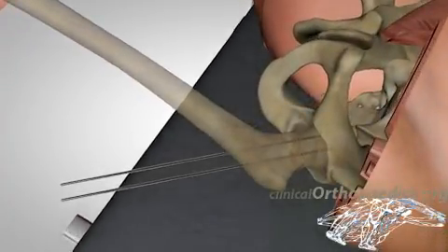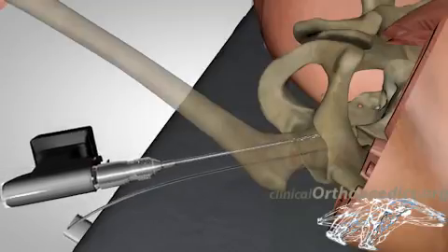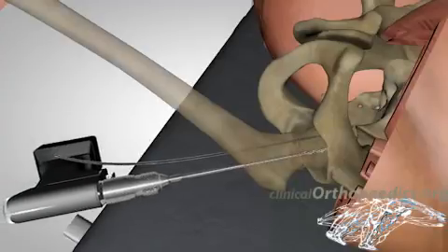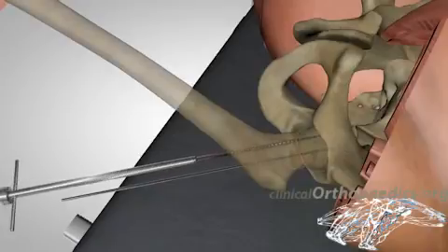The two wires guide the cannulated drill bit, ensuring correct position of the screws. The length of the cancellous screws is measured and the screws inserted over the wires.